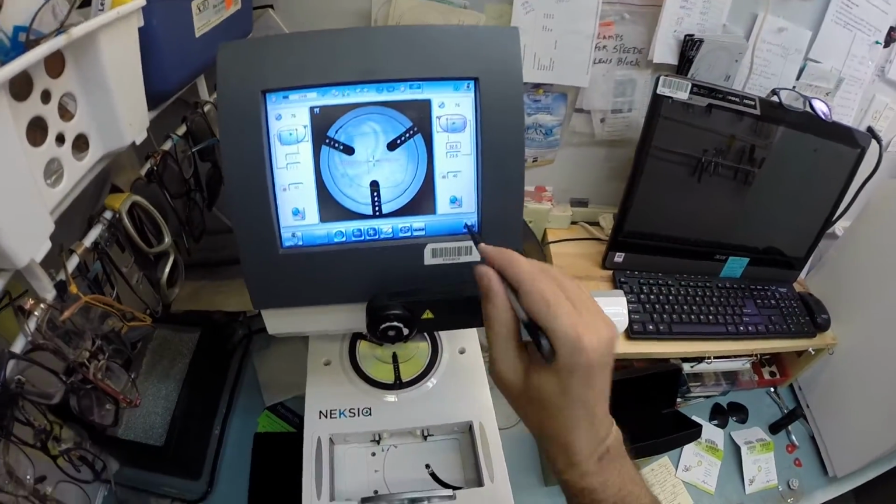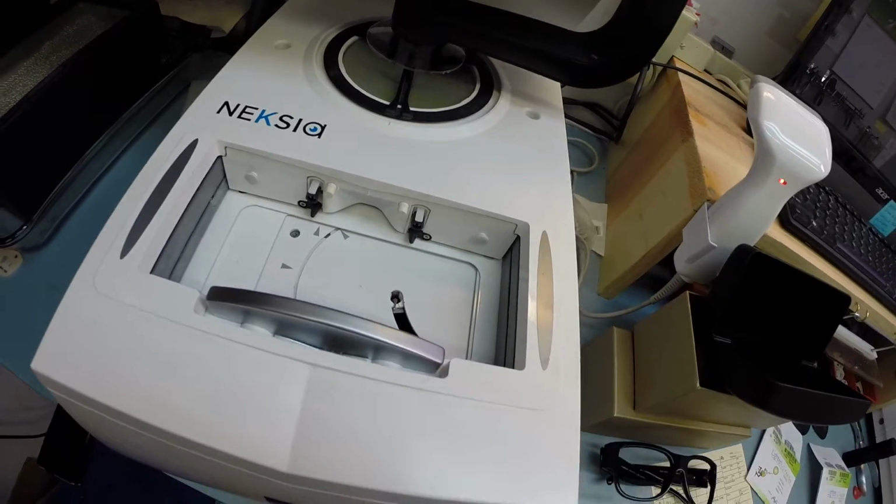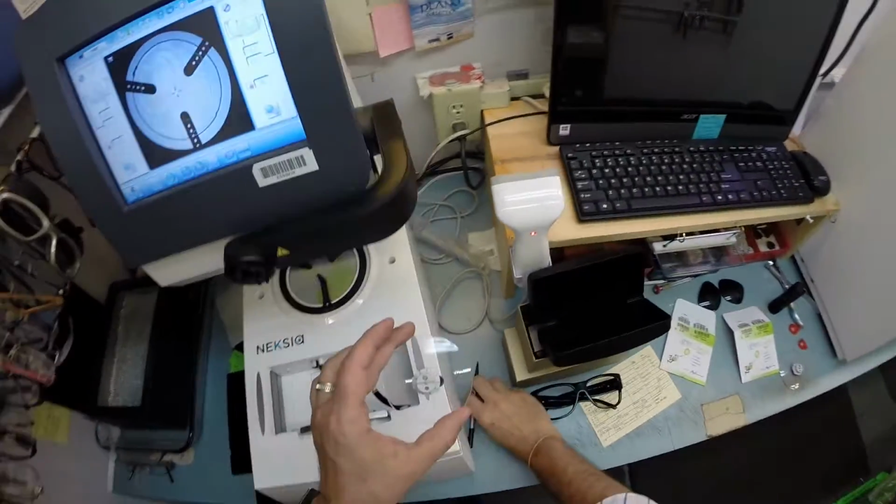Place that in there, hit the button, and now the arm's going to come down and place the block onto the second lens. But this, for all intents and purposes, will be the left lens. Let's just call it that.